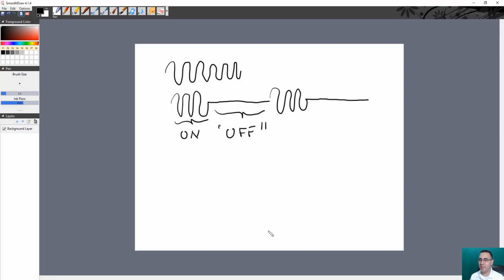It happens real fast. Now, the acoustic parameters that have to do with these two spaces of time are, for the on time, the pulse duration. The name tells you how long the pulse, the on time, is.